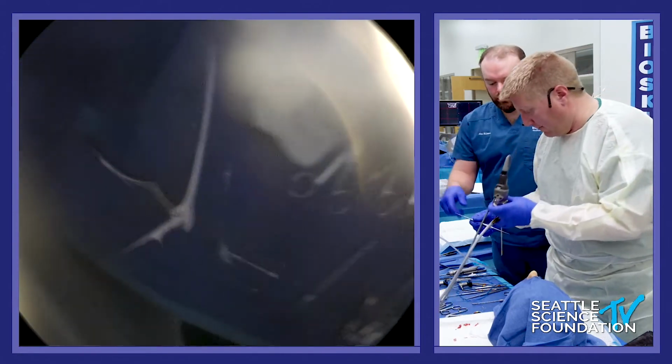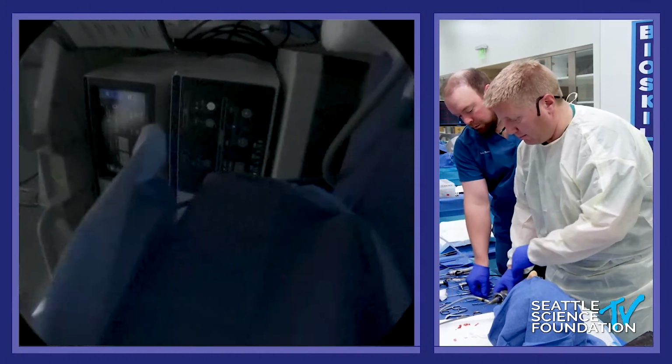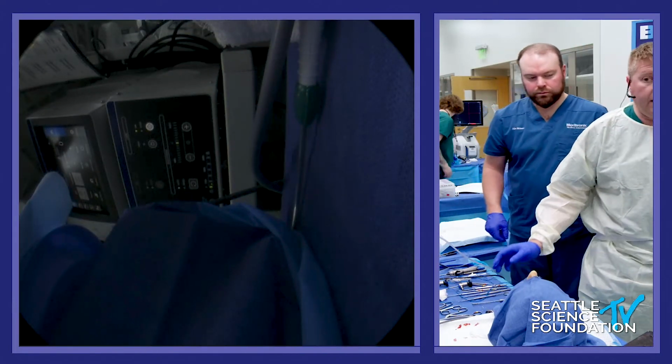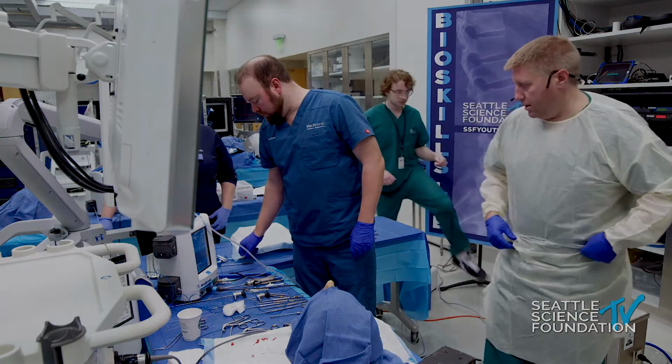So that's the nasoseptal flap and the pituitary approaches. And then I think Brad is going to do a frontal sinus drill out. If there's any questions, happy to take them.